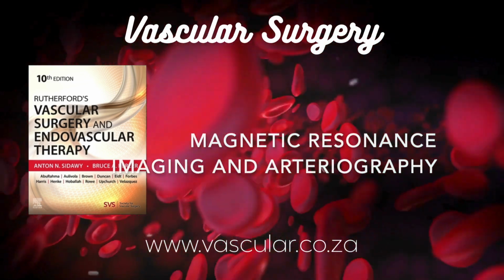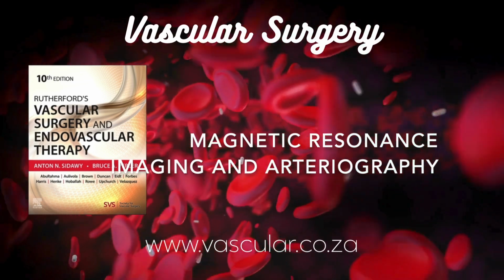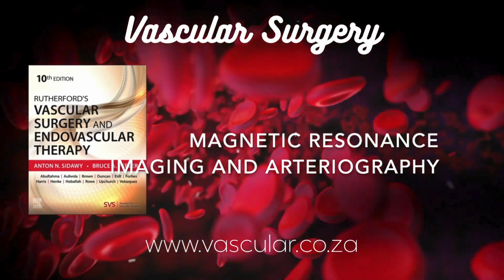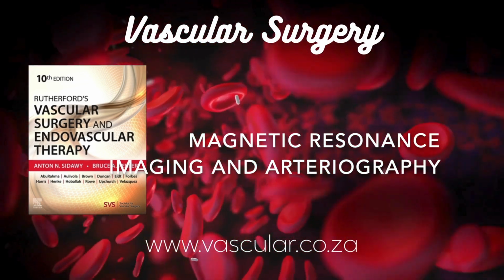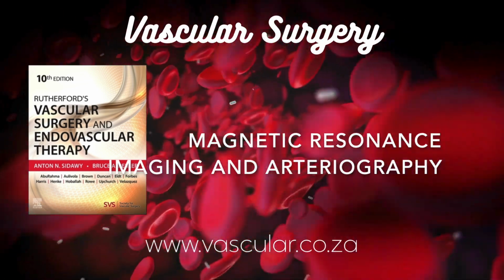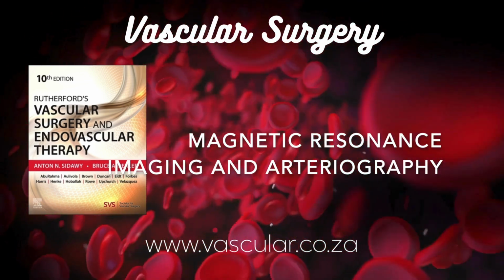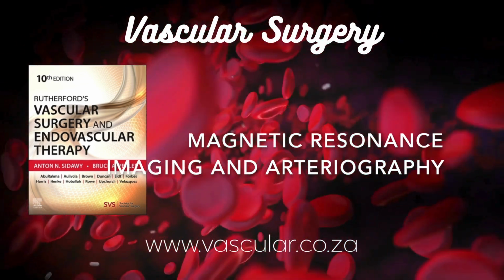And how strong are we talking? The textbook mentioned Tesla units. Yeah, exactly. Most clinical MRI systems you'll find operate at field strengths of 1.5 or 3 Tesla, that's T. Although, interestingly, the book does note that 7 Tesla systems are now starting to be used clinically, mainly for imaging the head and extremities. Wow, 7 Tesla. So higher Tesla means more powerful magnet.